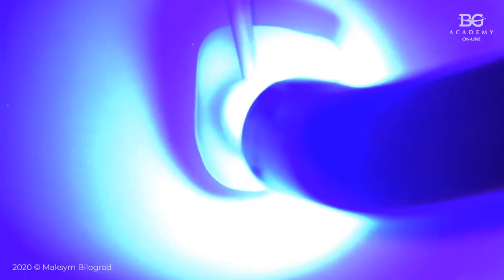Okay, just for reinforcement, then light cure again. So this is one of the plenty options. Or you can do nothing.